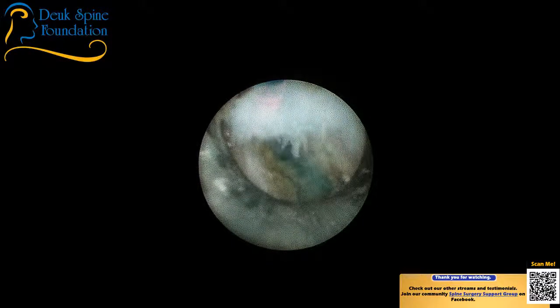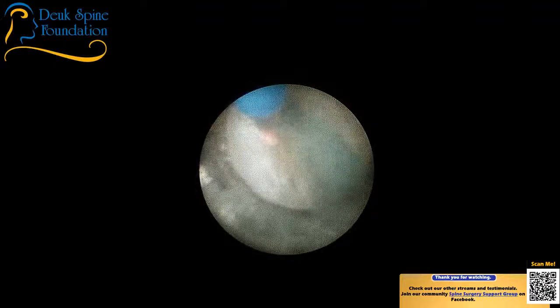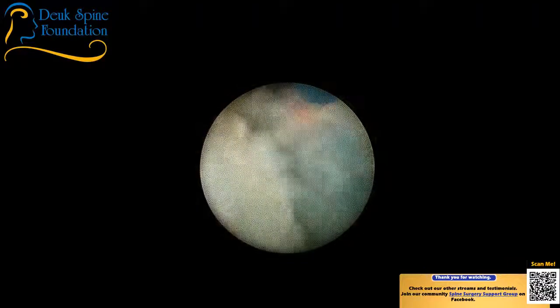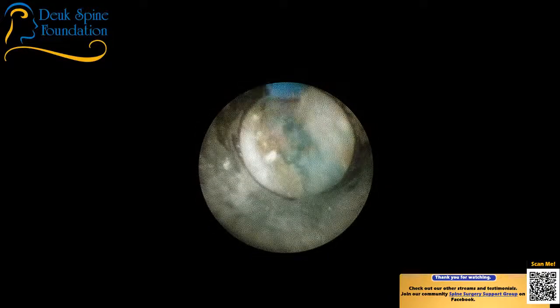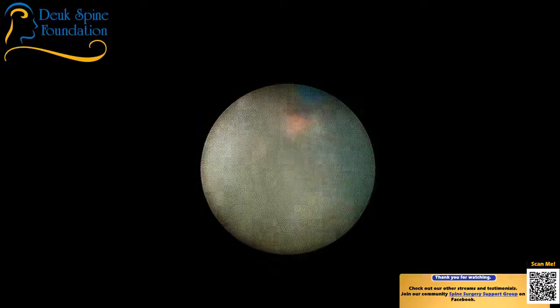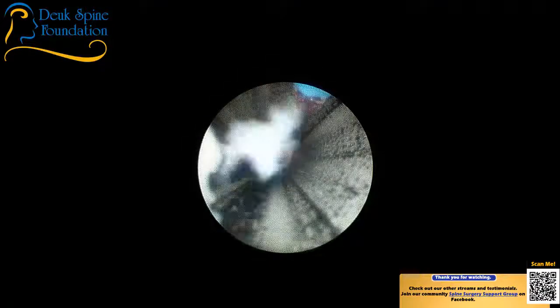I'm just making sure I've gotten everything I can. I'll be done at this level in just one more minute. That's the foramen right there, by the way. I think I told you that. Uncinate process. There's really nothing more in the foramen. It's completely devoid of herniation. Just some ligament, it's thickened, but all the herniation is gone. That's just posterior ligament right there. I don't see any more herniation. I think we're done here. That's the good news.